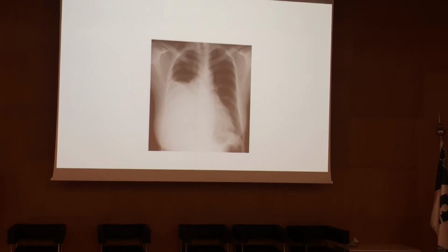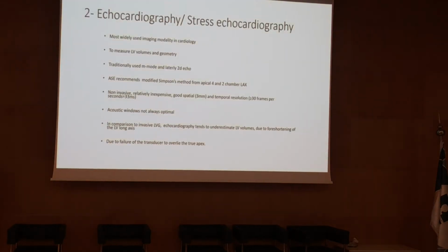And this is a classic when you see a patient with right side pleural effusion and suspicion of cardiomegaly here. This is typical for what? Heart failure. So in heart failure, they commonly come with right-sided pleural effusion. And this is an exam question. So this is very common. And you cannot comment on type of fluid on X-ray. Okay, so second, any question on X-ray?